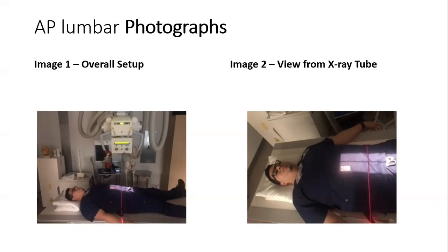I placed the image receptor inside the table bucky and made sure that the anatomy in question was centered on the IR. I selected the 14x17 image receptor for this examination. I inserted the IR portrait style inside of the table bucky for this examination. The IR was placed inside the table bucky at precisely 40 inches.